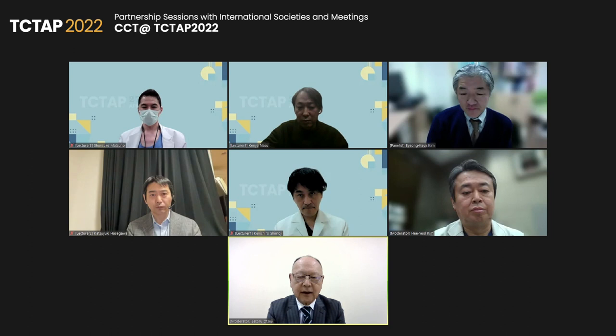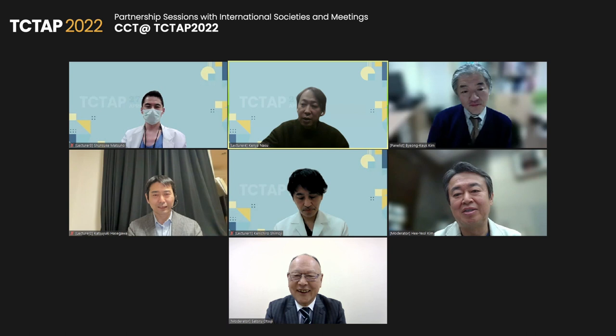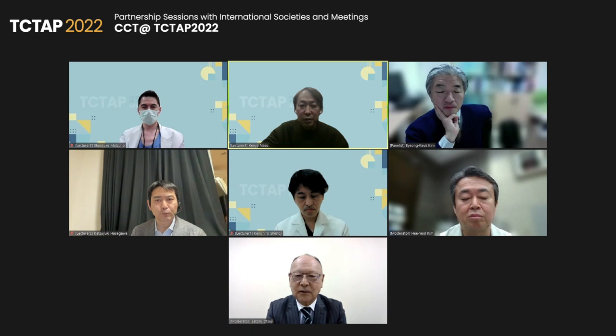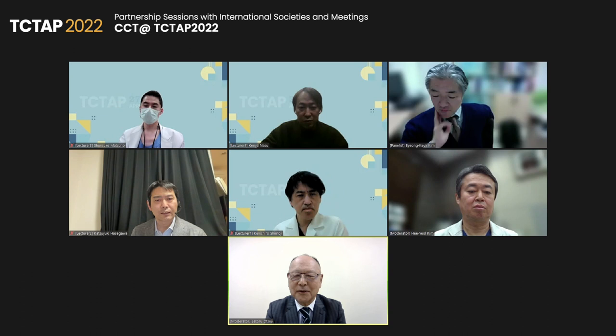Very interesting. Thank you very much. When do you think this system will be available? I think in Japan in 2024 or 2025. Okay. So it is only available in sinus rhythm? Yes, of course, with the heartbeat synchronized system, we can use it only for patients with sinus rhythm, because the RR interval is different if we have a PVC. Yeah, right. Okay. Thank you very much.